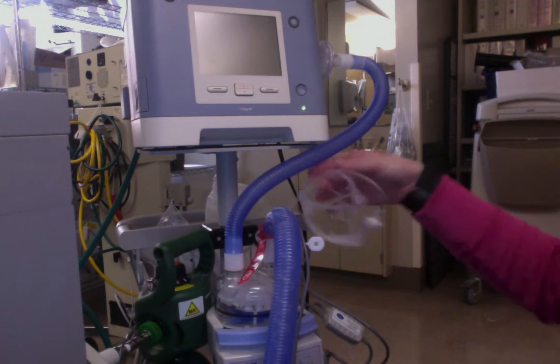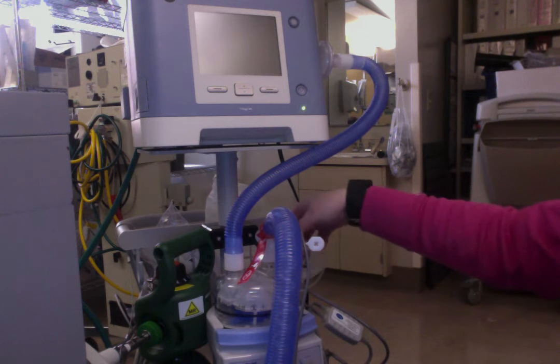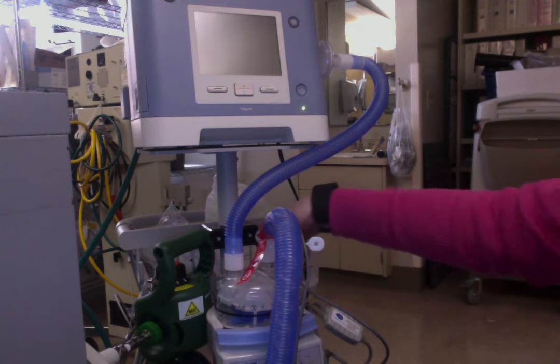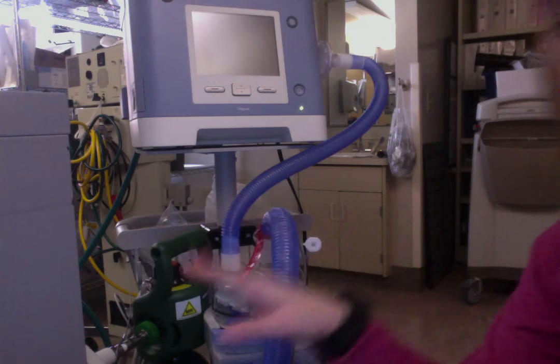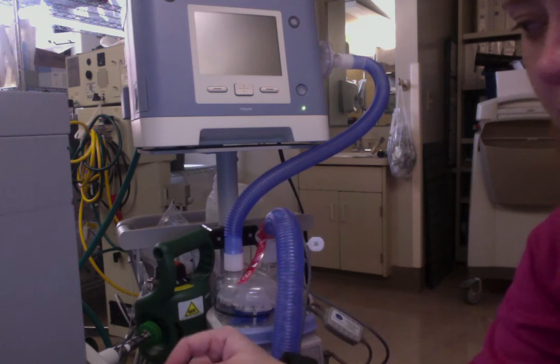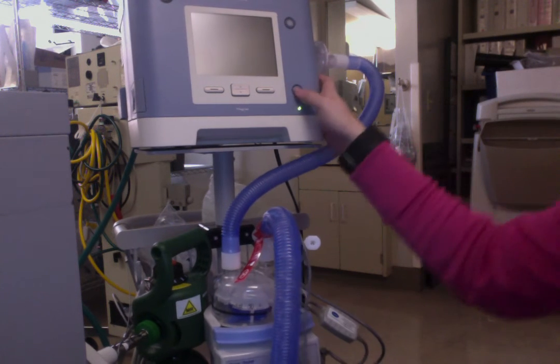And then you're all set up. I can spike my water bag when I'm ready to go and use this, and then it will be all set up for patient use. So I've got it plugged in and plugged into my oxygen. I'm going to go ahead and turn it on.